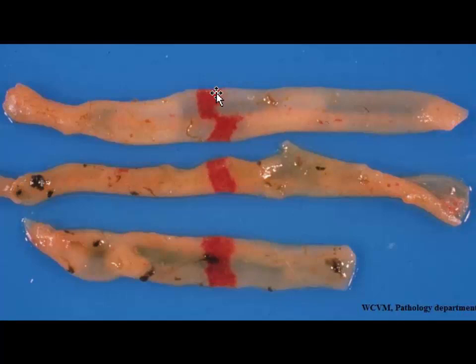Okay, hemorrhage and necrosis of the Peyer's patches. And that would be an absolutely fine morphologic diagnosis for this. Focally extensive Peyer's patch necrosis with hemorrhage. That would be great. If you said segmental lymphoid necrosis and hemorrhage, I'll take that too. Okay, and when you see this in the intestine of a duck, you want to think about duck plague or duck viral enteritis.